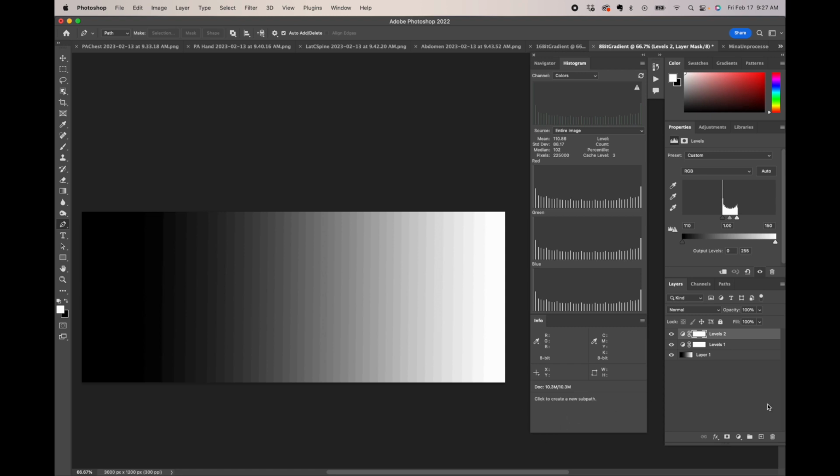What we do have control over, though, is our technique and paying attention to the exposure index value for the specific vendor that makes the machine we're working on. It's been a source of frustration to me that there is no consistency between exposure index values in radiography as there is in photography.